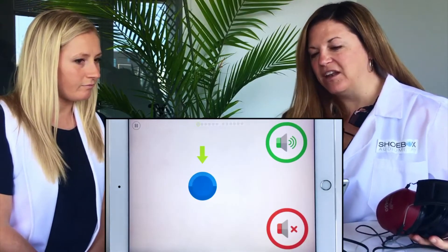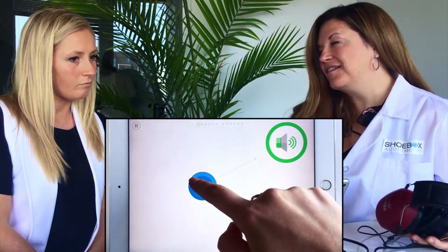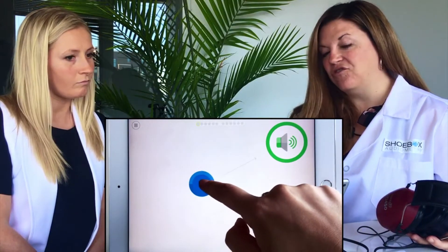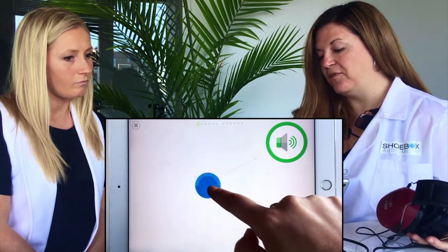Here's the platform that you're going to be testing your own hearing on. We would like for you to touch on the blue disc. If you hear a sound, you drag and drop to the green circle. If you don't hear a sound, you drag and drop to the red circle.